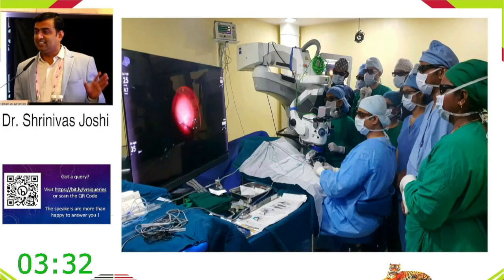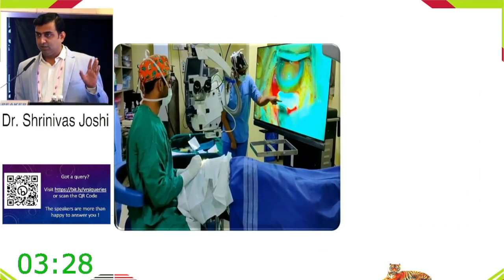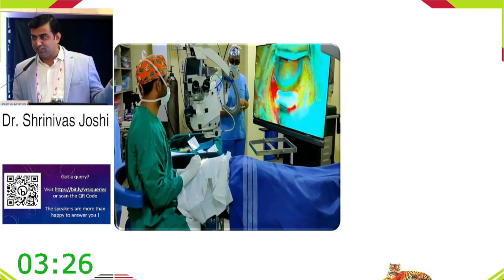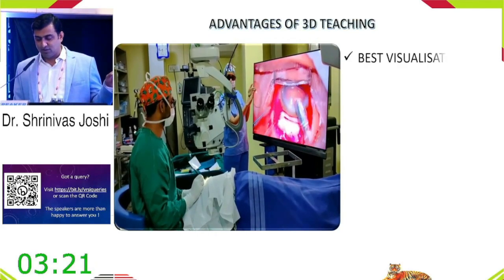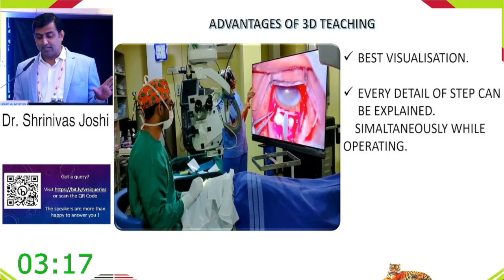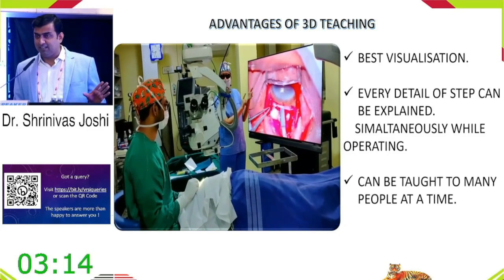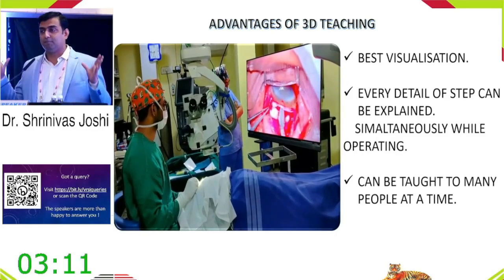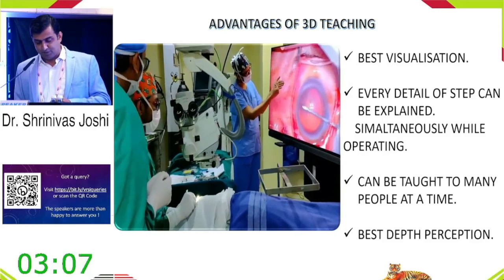And it's a fantastic teaching tool, where many of the fellows can be taught at the same time. Now you can see here a third year resident teaching the first year resident. Advantages: definitely it has one of the best visualizations. Every detail of the step can be explained simultaneously while operating, and can be taught to many people at the same time. It's like a kind of glorified blackboard teaching. And definitely it has one of the best depth perceptions.